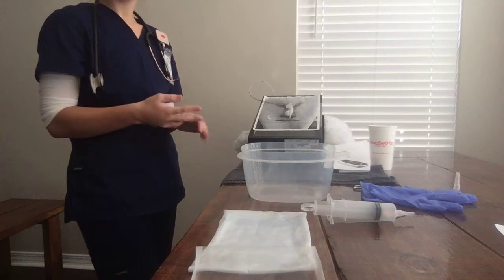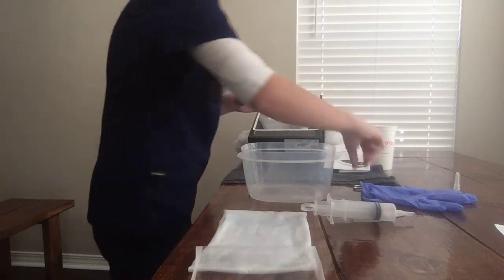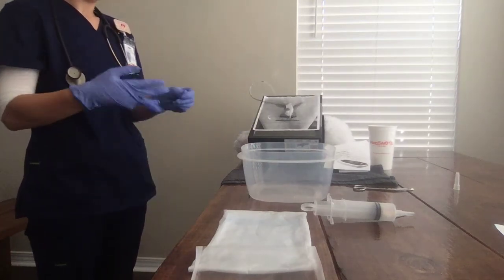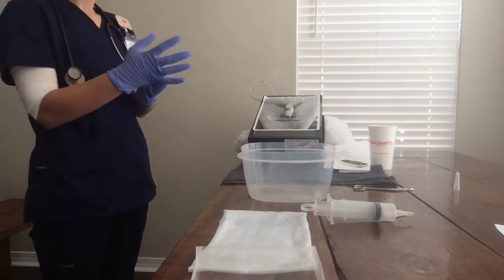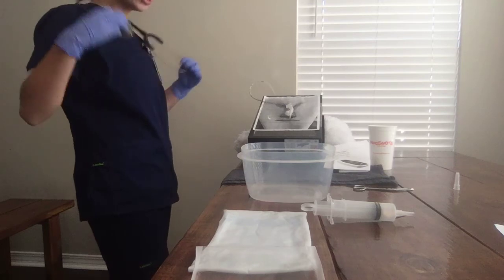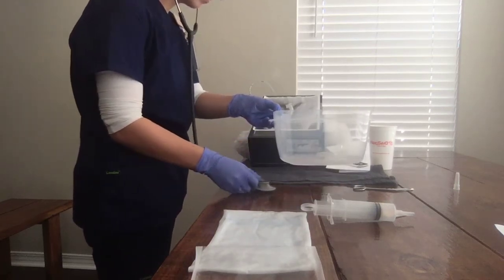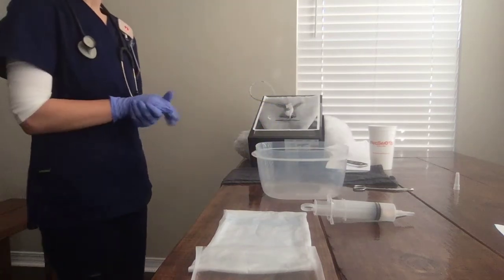So to remove it, I would verify the order, perform hand hygiene. I would explain the procedure to the patient. I'm going to put clean gloves on, and I will raise the bed and lower the side rails. I'm going to auscultate the bowel sounds. And then I would place the patient in a high Fowler's position.